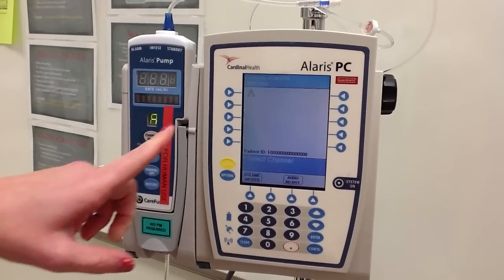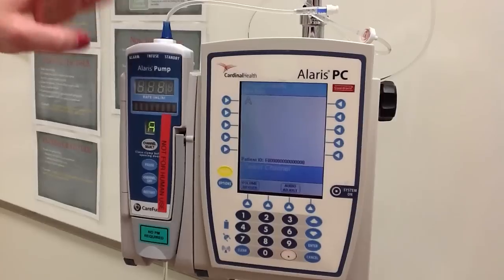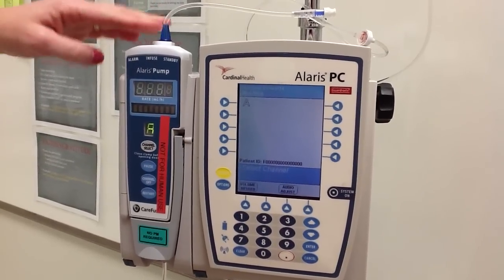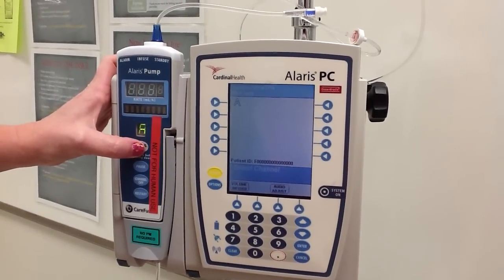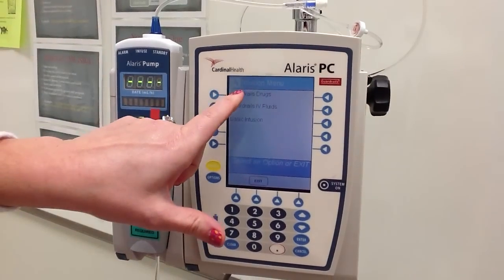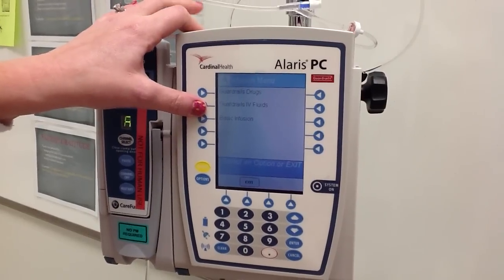Then it's going to ask you which channel you want to run your fluids on. You can have up to four chambers or channels. For this pump, we just have one channel — channel A. So I want to select channel A for my IV fluids. Then it's going to ask whether I'm going to give a medication, run IV fluids, or a basic infusion. We want to hit guardrail IV fluids.